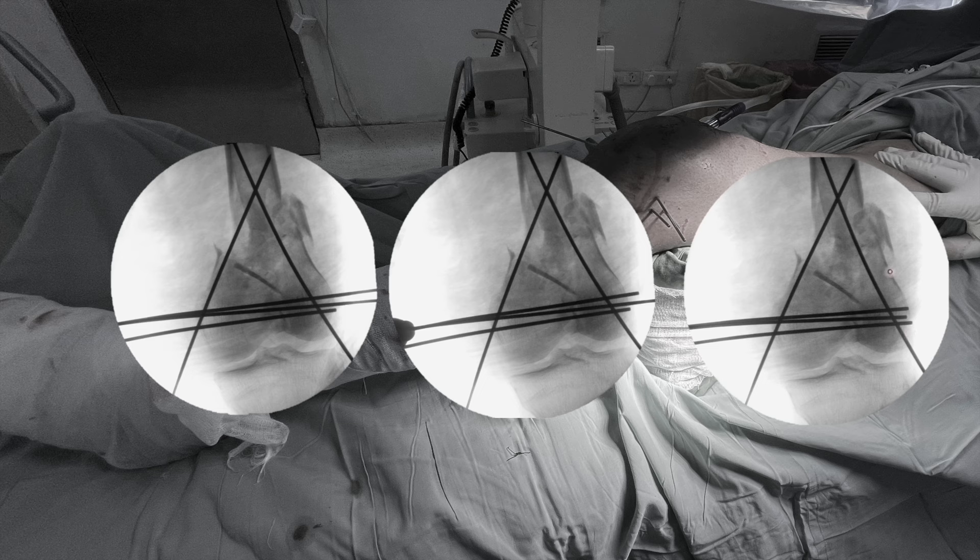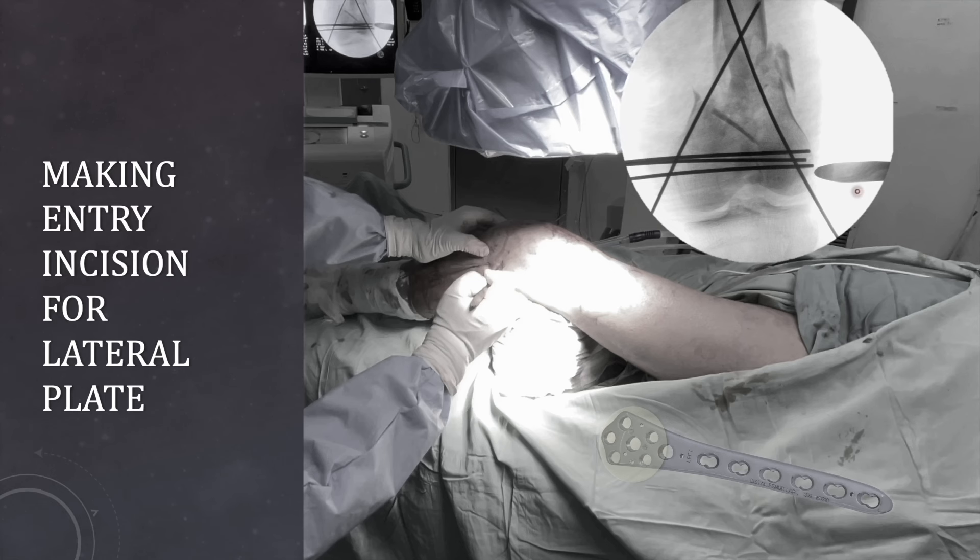Your lateral surface is now completely free and you can easily pass the plate over the surface. The next important thing is to mark the entry incision for plate placement. You can use any instrument to locate the terminal part of the articular block — your terminal screw should be just above the topmost extent of the articular surface. Therefore the position of the plate should end somewhere here, and the incision should be of a length sufficient for placement of the peri-articular screws.